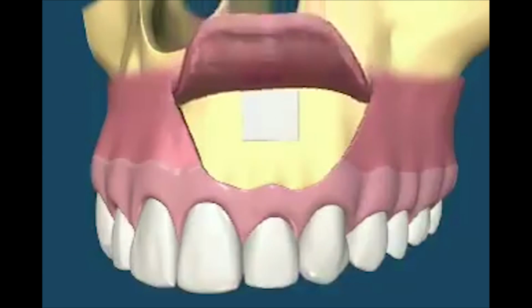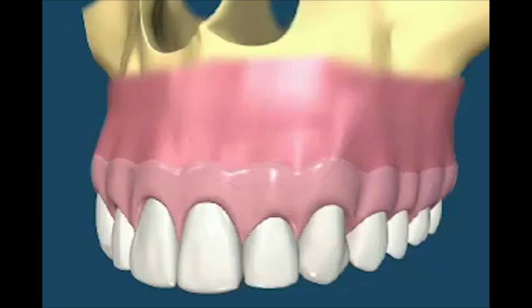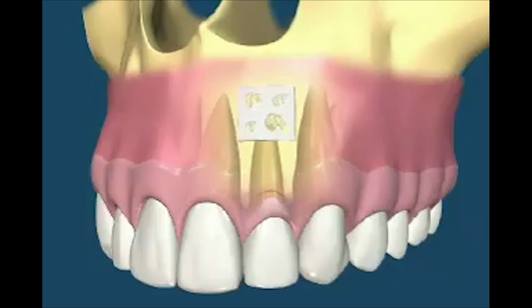The flap is repositioned and sutured into place. The sutures are removed or they will dissolve. This procedure surgically and immediately removes the pathology. The swelling disappears. The membrane dissolves. The bone substitute turns into the patient's own bone, and the tooth is saved.